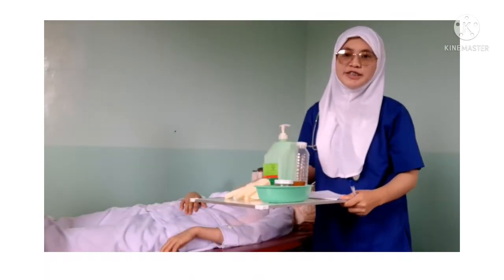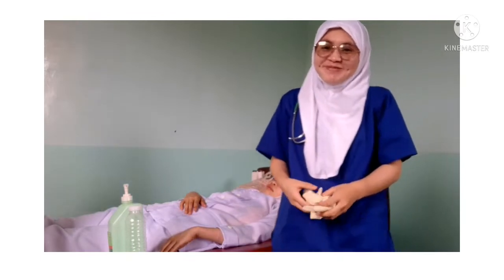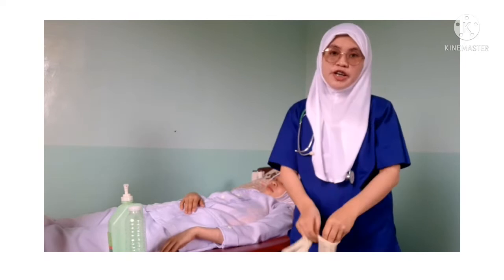So here is the equipment. Now do hand washing. Do hand washing and don clean gloves to prevent spread of microorganisms.